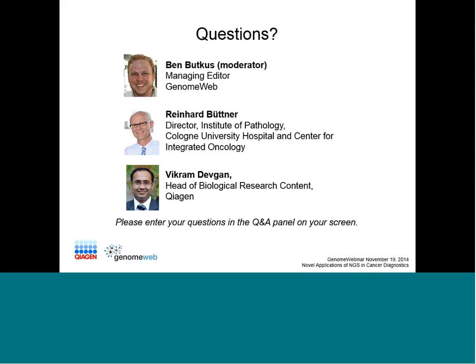Thank you. Our next question is for Vikram Devgan. Vikram, even after enrichment, do you see degradation like Dr. Buettner showed in primary samples? So when we are talking about degradation after enrichment, there is a cleanup step, which will get rid of the so-called degraded samples which are getting carried over after the target enrichment. So we do have a purification step after the target enrichment, which can get rid of all these degraded samples.